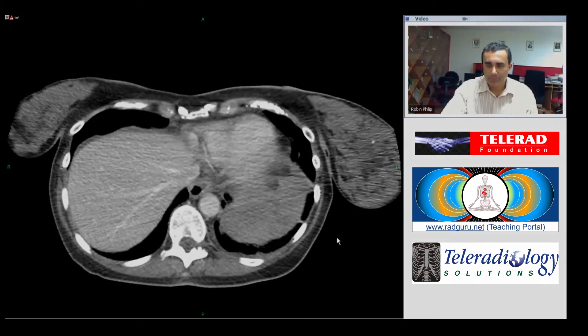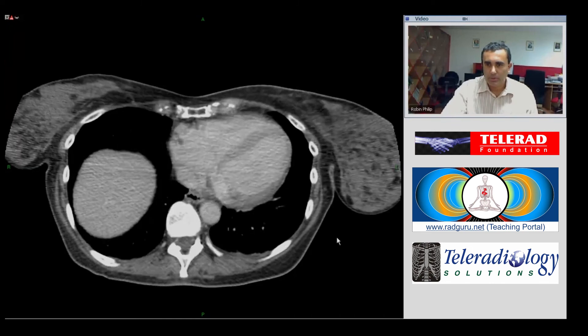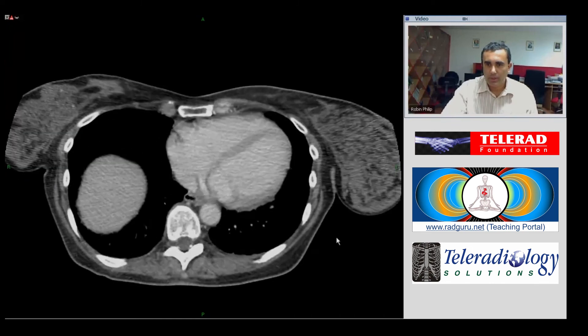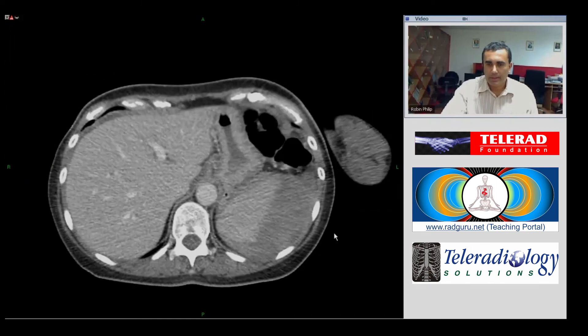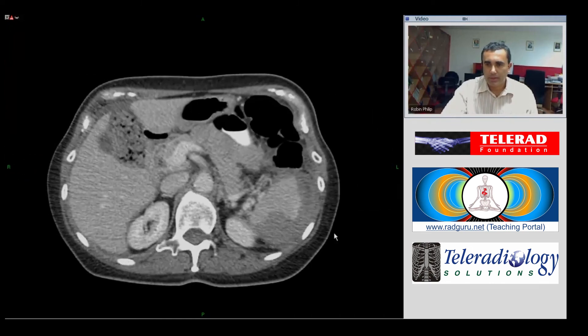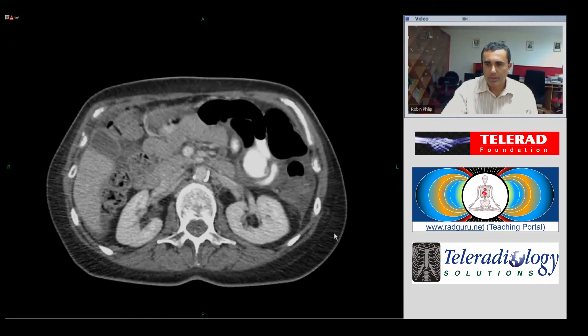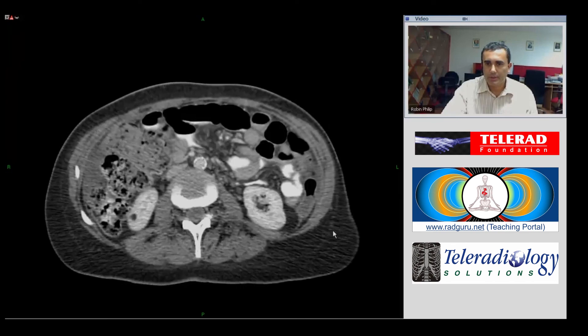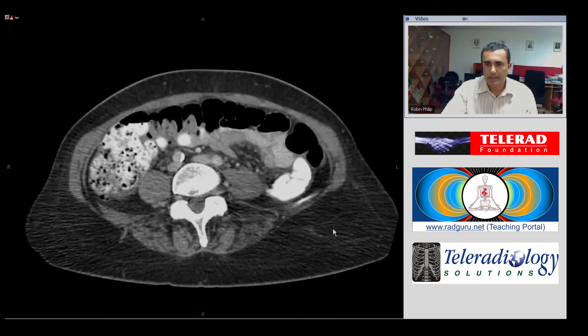So this is something to look out for in patients presenting following colonoscopy with left upper quadrant pain. Thank you.